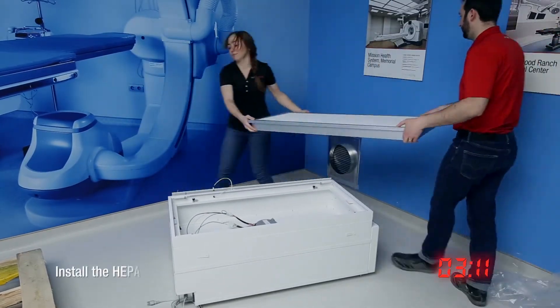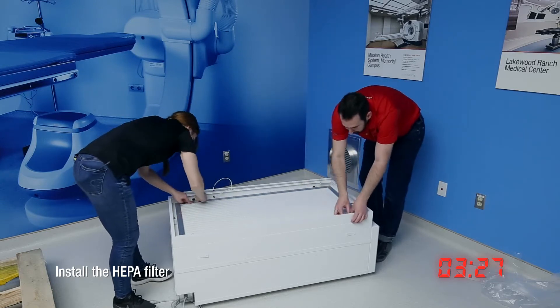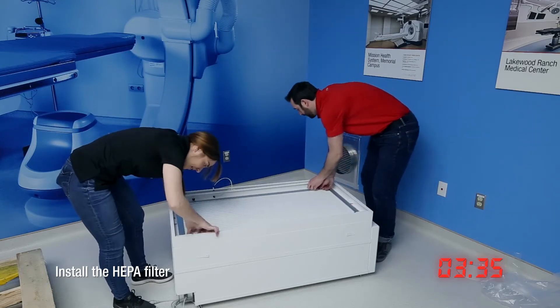Taking care not to touch the filter media, install the HEPA filter in the fan filter unit using the tabs and thumb screws to secure the filter in place.